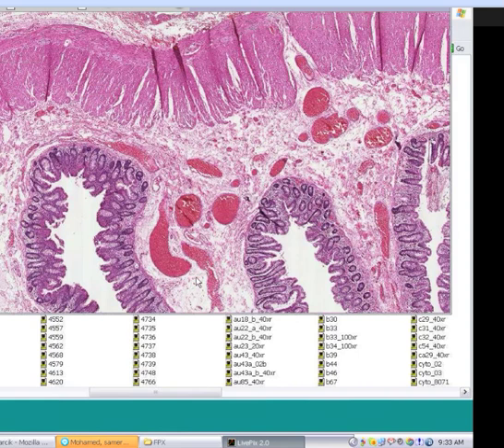Pretty much you're all getting it at the same time. Here's your mucosa. Here's your submucosa. Here's your circular layer. Here's your longitudinal layer. You could probably see Auerbach's ganglion collections here and here, so you know that's part of the bowel's intrinsic brain system. And then you see some connective tissue of the serosa or adventitia.